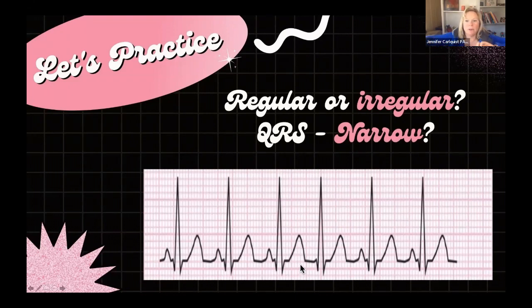So right here, what you're seeing, this one here, you've got PQRST, PQRST, PQRST, no P, just QRS and T. So when you're missing a P, but it's still narrow, under 3 small boxes, that can only be one guy who's running the heart.